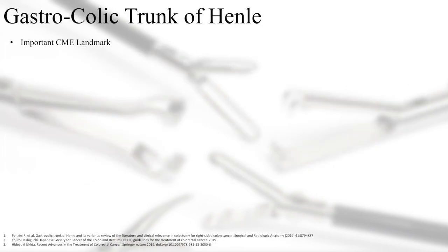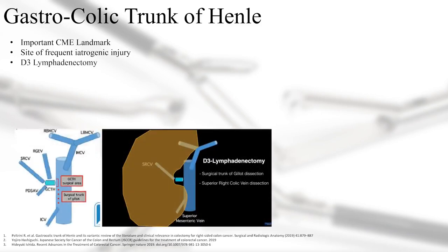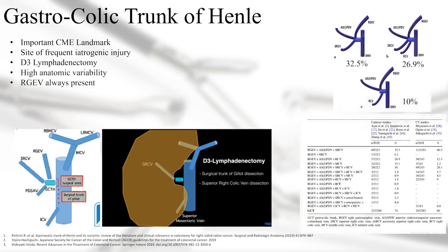The gastrocolic trunk is an important CME landmark for two reasons. The first is possible perioperative bleeding, especially during the separation of the mesocolon from the pancreas — it is the second most injured vascular site during CME after the superior mesenteric vein. It has high anatomic variability, with only the right gastroepiploic vein being always present. The lymphoadipose tissue located on the anterolateral aspect of the superior mesenteric vein from the ileocolic vein to the trunk of Henle is called the surgical trunk of Gillo and must be cleared during central lymphadenectomy.